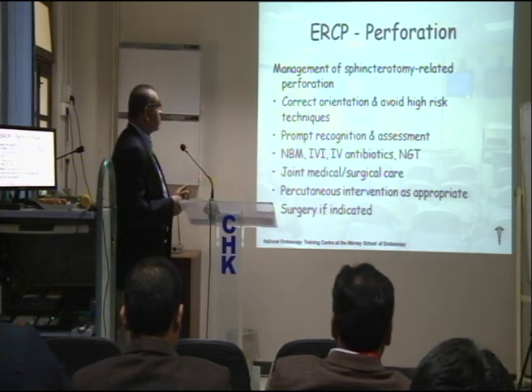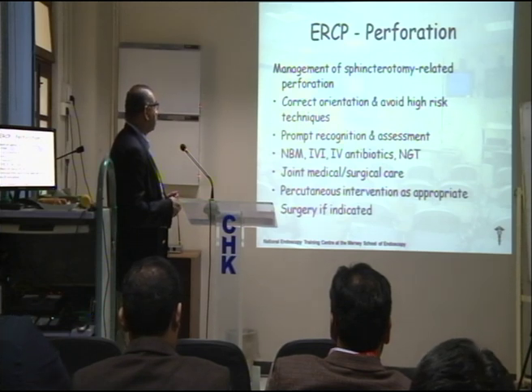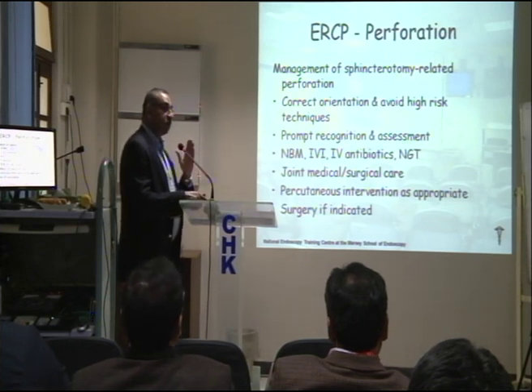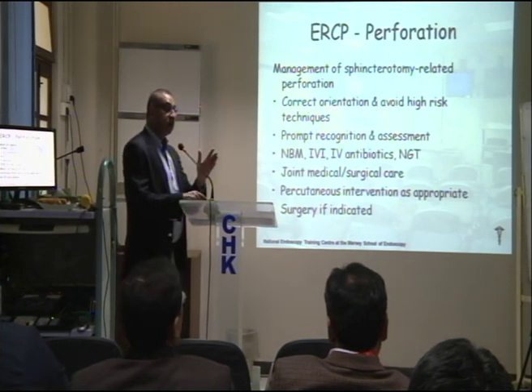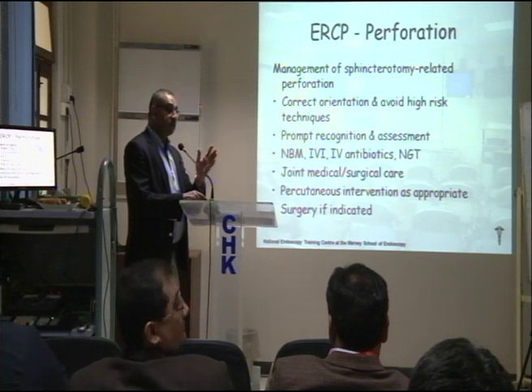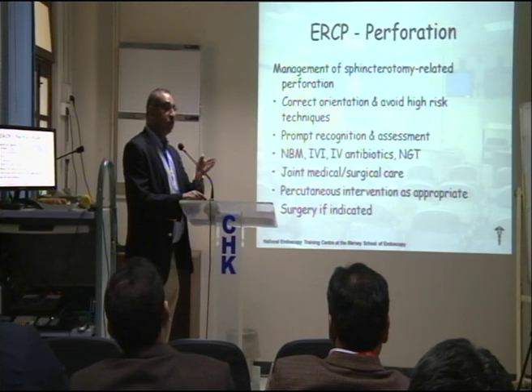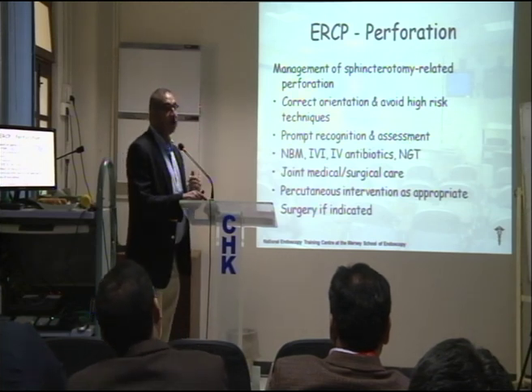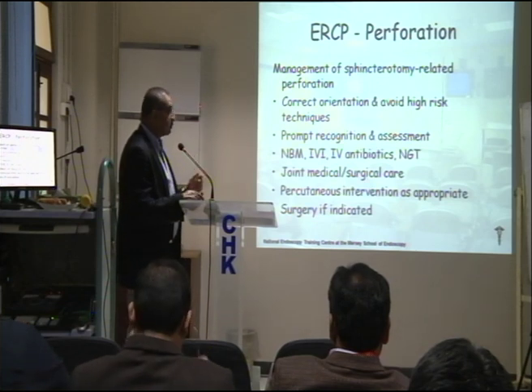Early recognition is always important. To carry out your sphincterotomy, you must make sure that your cannula is deeply embedded into the CBD. Don't attempt sphincterotomies if you do not have deep cannulation. Some people try to cut through like that. It should not be done.